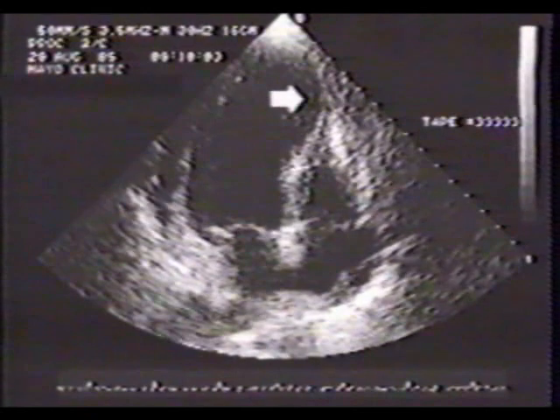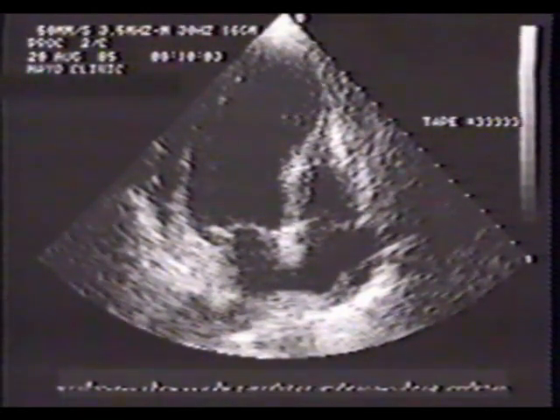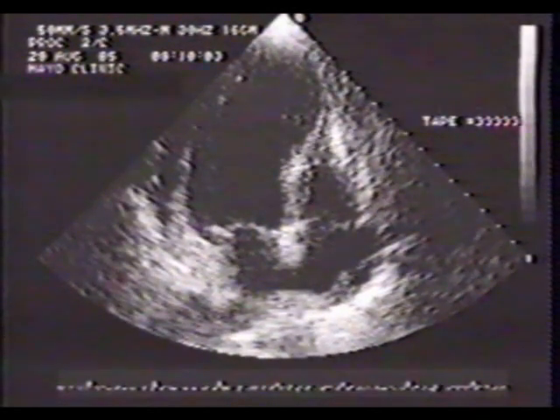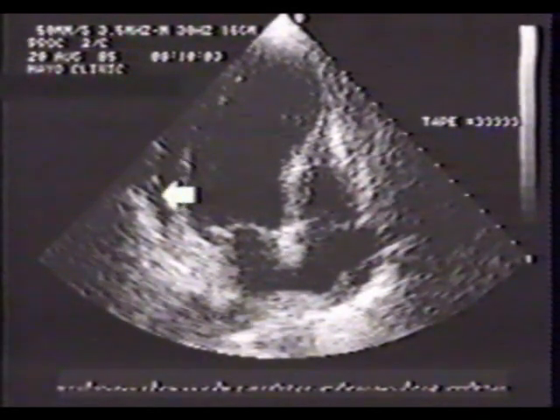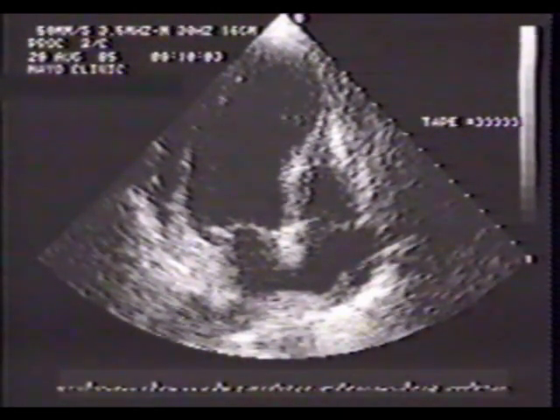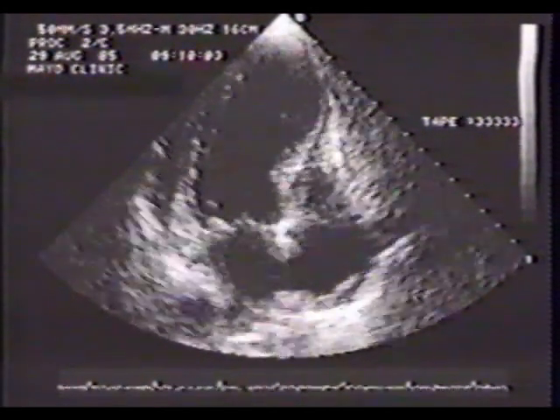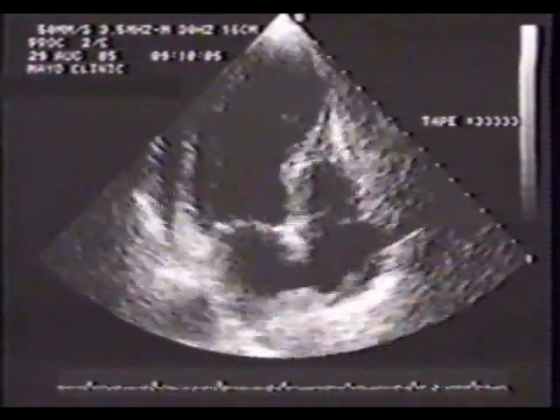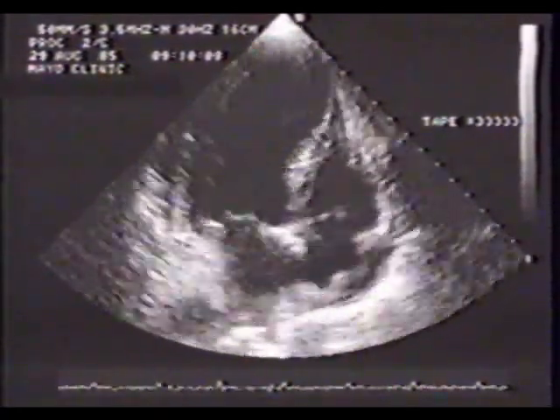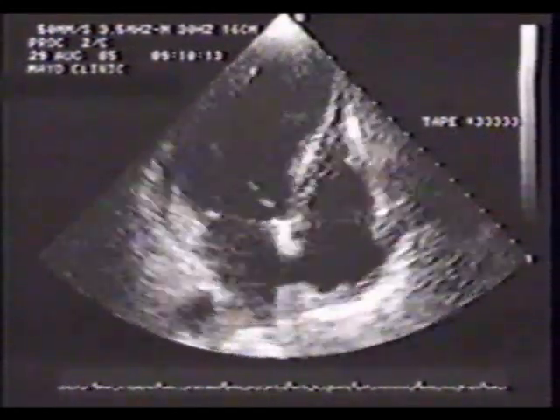This patient has an apical infarct, which will be better appreciated in real time. A small pericardial effusion is evident lateral to the left ventricle and around the right atrium. In general, pericardial effusion associated with myocardial infarction is small to moderate in size. Fortunately, tamponade is rare following myocardial infarction. When it does occur, it should raise the possibility of cardiac rupture.